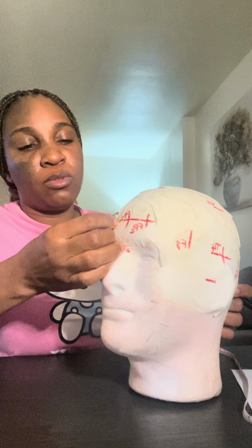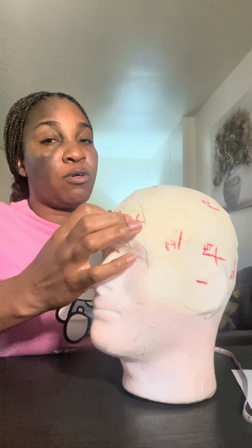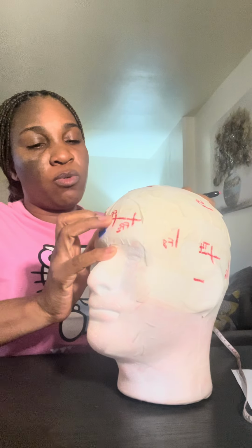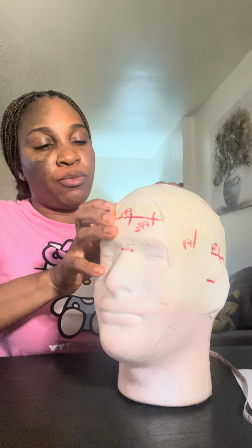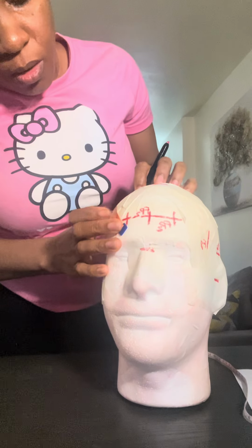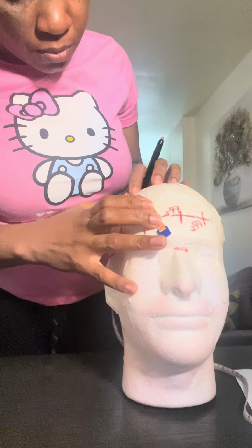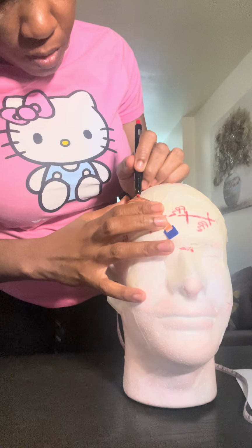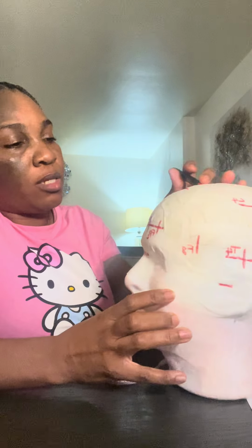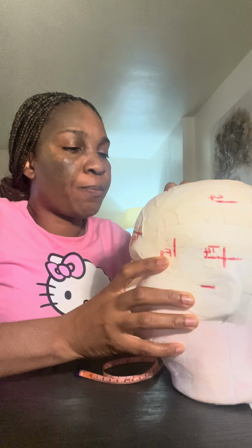Okay, 24, my parasagittal is divided by 4, so 24 divided by 4 is going to be 6. So putting my 0 mark on FP1, going through C3, 6. Okay, this is the 6th mark. All right, and this is going to be my F3.